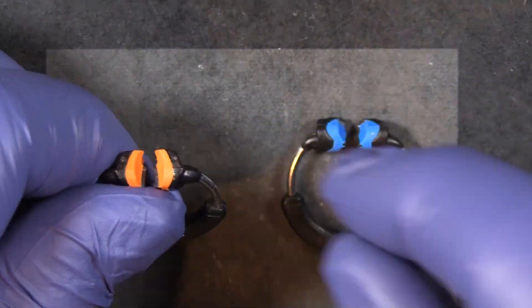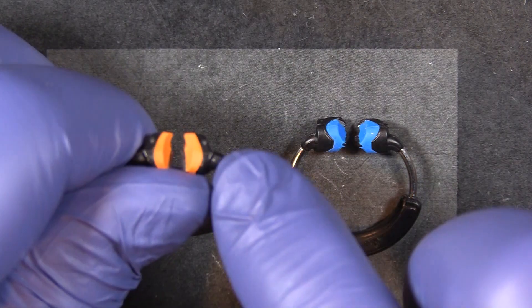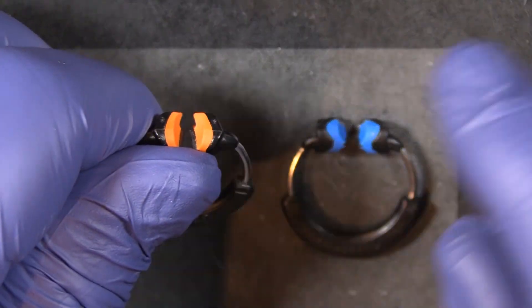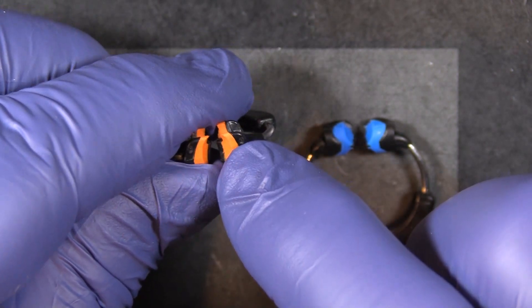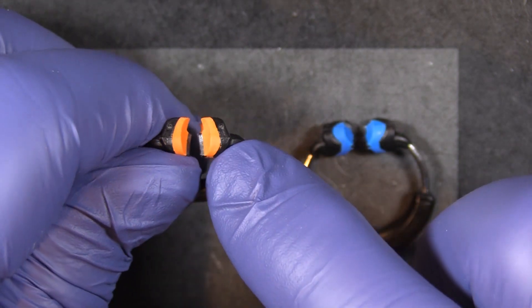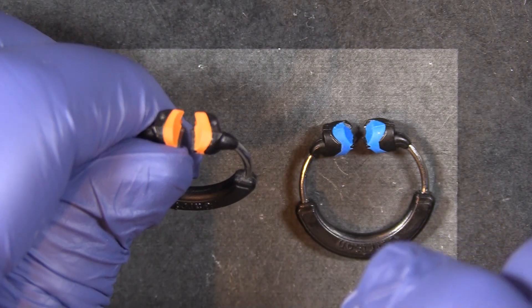The soft face silicone was such a huge hit — it allows the ring to adapt so nicely to the tooth and cut down on flash. The only dilemma was that with this full silicone down the whole length of the face, there were times when the ring did not like to retain on the tooth.